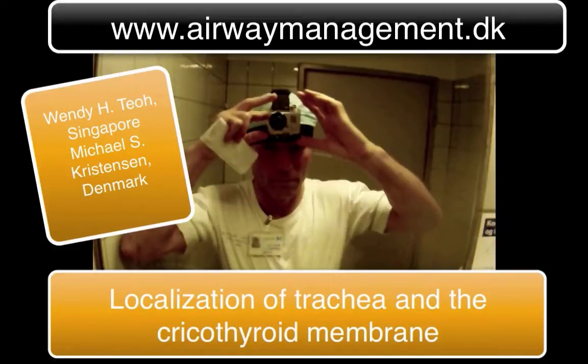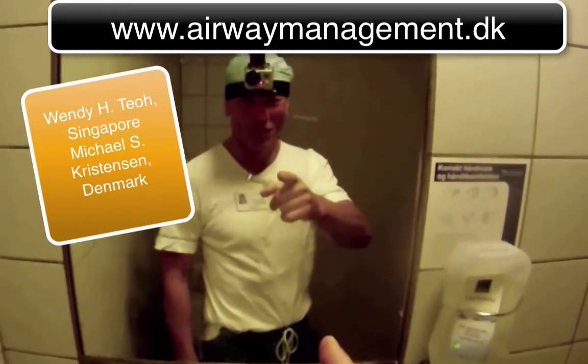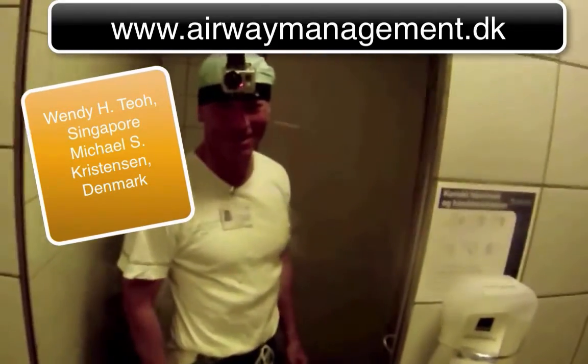I mount the GoPro camera and then I'm ready to try on a real patient.